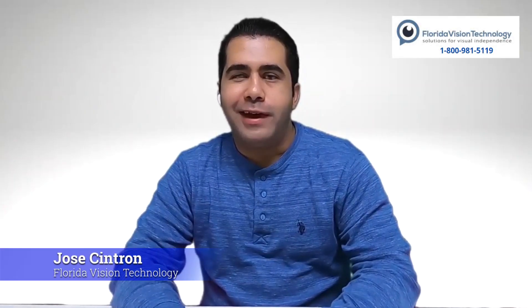Hey, what's going on guys? It's Jose again from Florida Vision Technology. Today we're going to take a look at the Read category of the Envision Glasses, specifically the Scan Text feature.